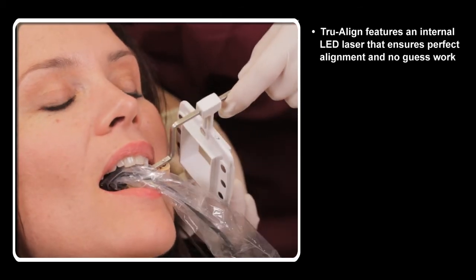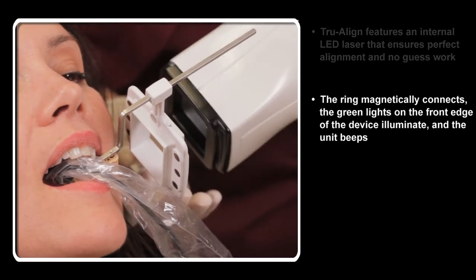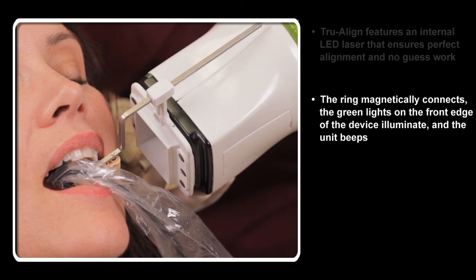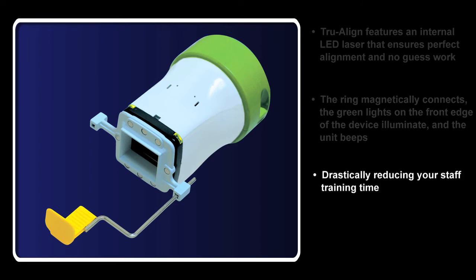When the laser and ring reflector are exactly aligned, the ring magnetically connects, the green lights on the front edge of the device illuminate and the unit beeps, indicating a perfect image every time. Even a novice can take perfect images in just minutes, drastically reducing your staff training time.